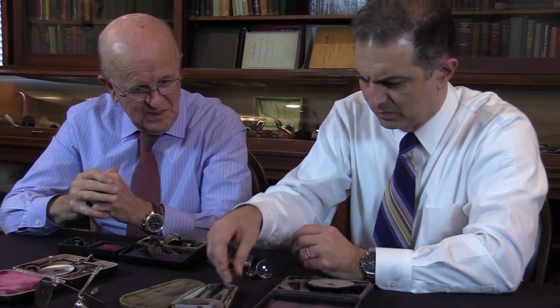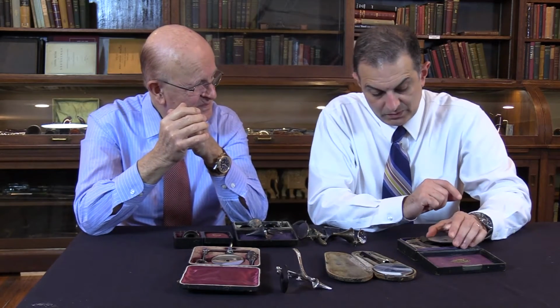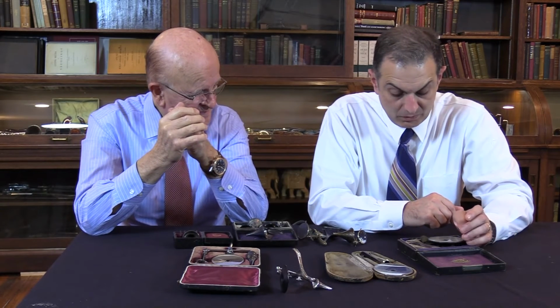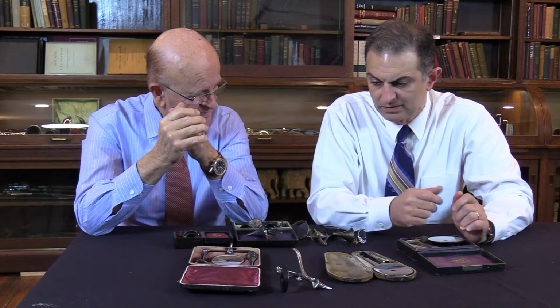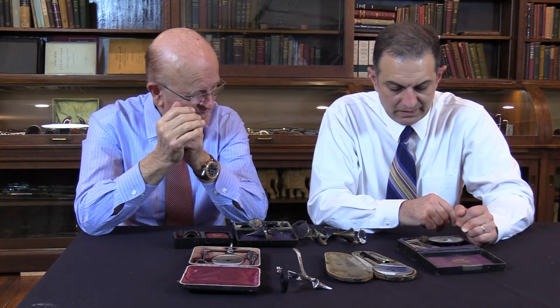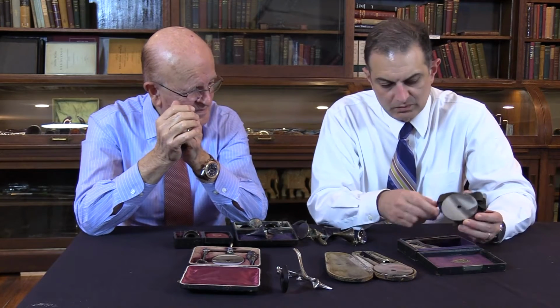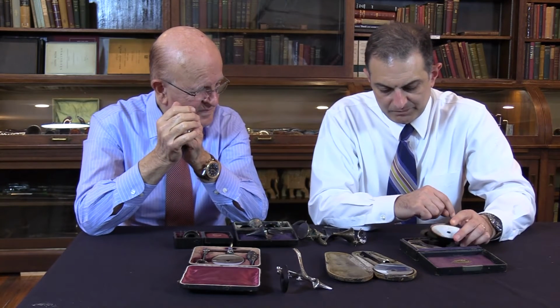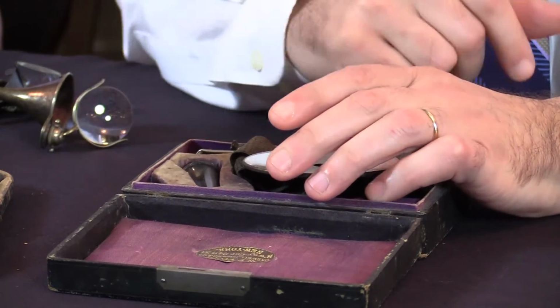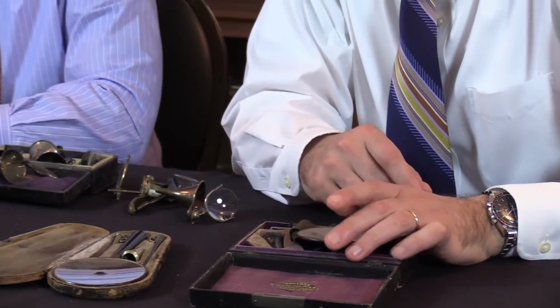And so, you know, it probably took a little skill to try to manipulate that. And I remember as a resident, that was one of the early things you have to learn, to figure out how to look through the head mirror and focus your light into the nasal cavity, or oral cavity, and oropharynx. And this is similar, but you really had one hand occupied with the mirror, the other hand occupied with the speculum. You know, this is a little bit more consistent with what we're used to, where we have the head mirror and the speculum. And even to this day, every now and then, if I have a head mirror on and I've got a light, if I just need to clean out a little cerumen, sometimes I might use that technique. But usually the headlamp instead of the mirror.